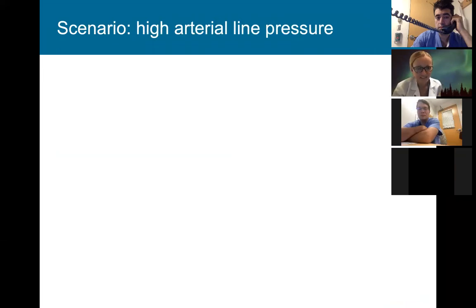The next one is a longer one. We can go with, is Andrew Baldwin back on the line? Sorry, Antonia, to interrupt you again. On your last slide, extremely important, what you said is correct, but extremely important to make sure that your clamp is fully applied, that you're not leaking from the systemic circulation into the heart. Yeah, very important point about distension during the operation. Okay, thank you. That's a very valid point. I will add that to it.